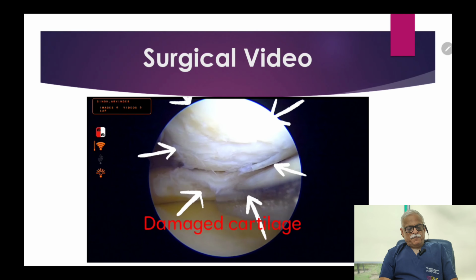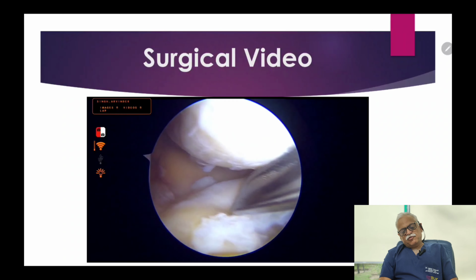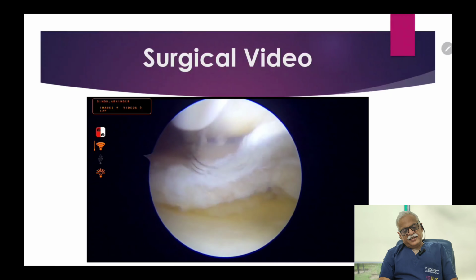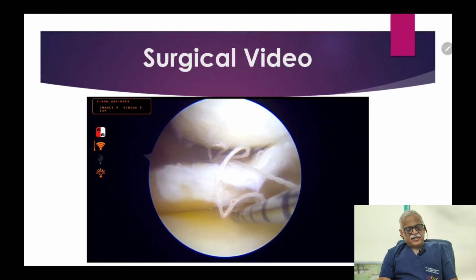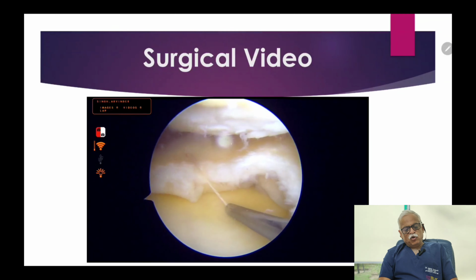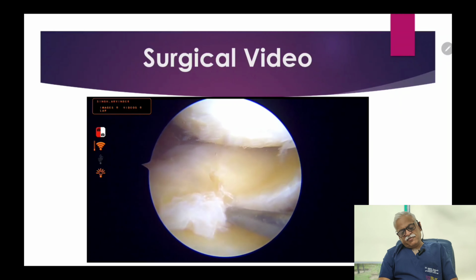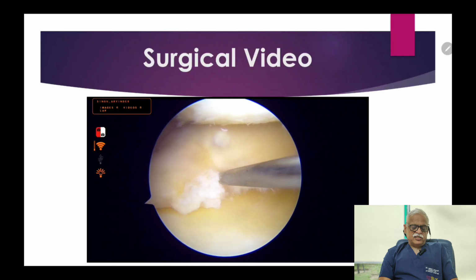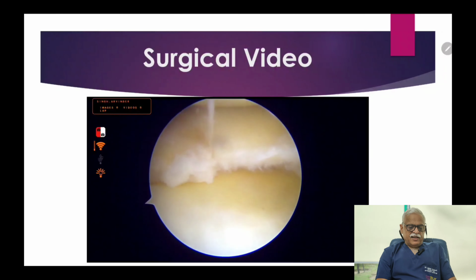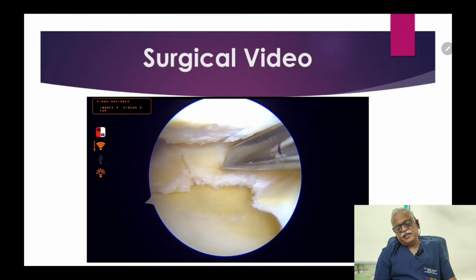Once you have prepared the meniscus, the next step is the repair, and for this horizontal tear, we use the all-inside meniscal devices, and they provide circumferential compression with one end going upwards and one below the meniscus, and you achieve circumferential compression. Depending on the length of the tear, 4 to 5 anchors on average are used for repair of a horizontal tear.